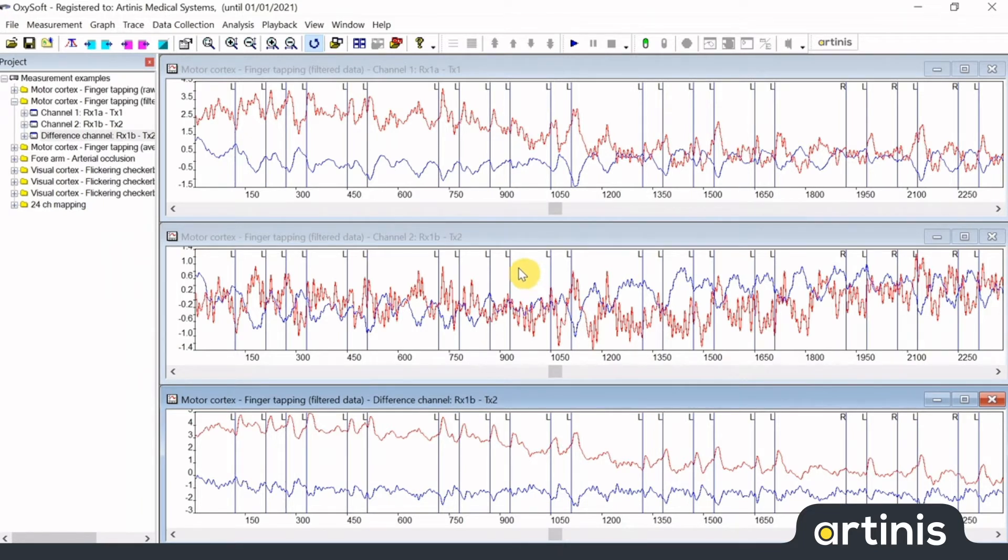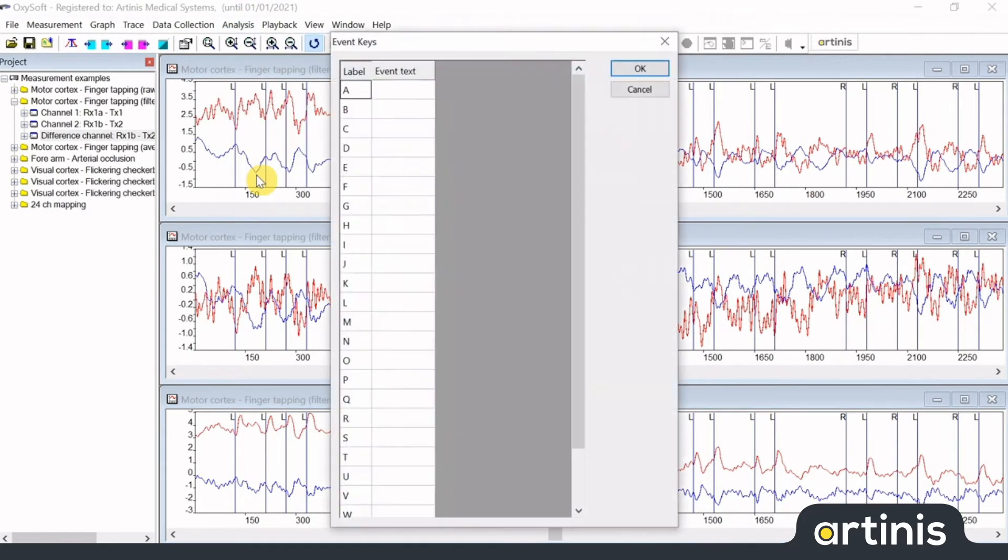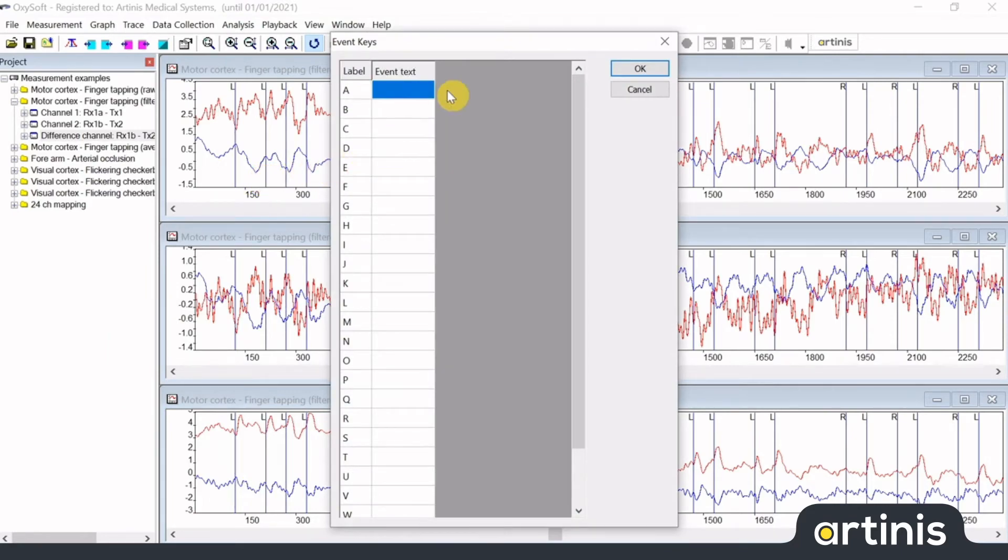You can define your event keys in advance of the measurement. Click on Menu Analysis Event Keys to get an overview of the event keys, and add an event text to describe the event.